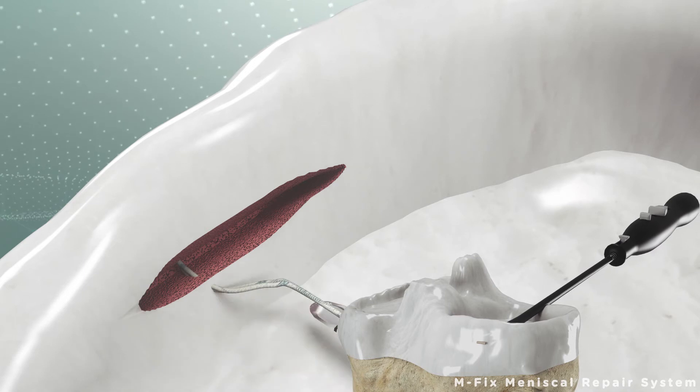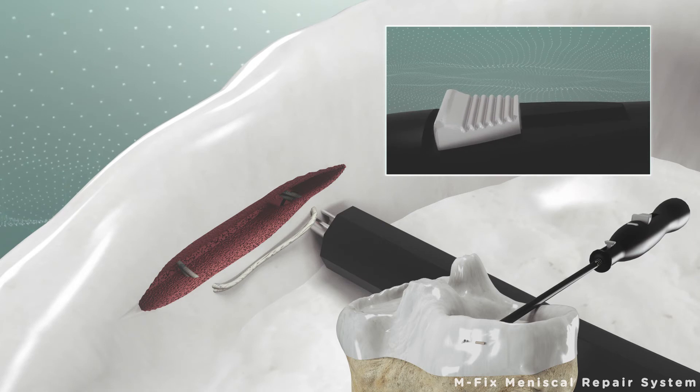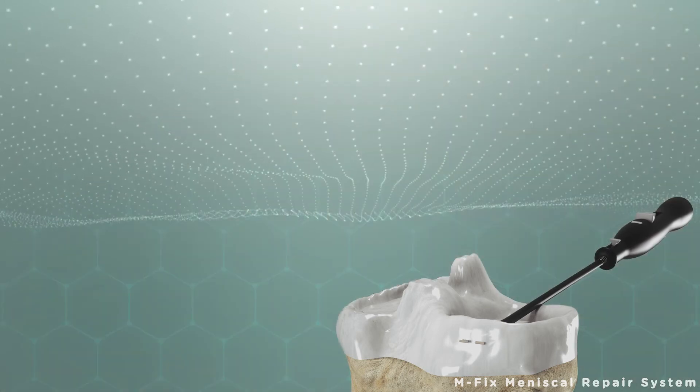The M-FIX device is removed from the tear and then placed inside again for the second time. The second implant can be placed into the tear by clicking the security button again.